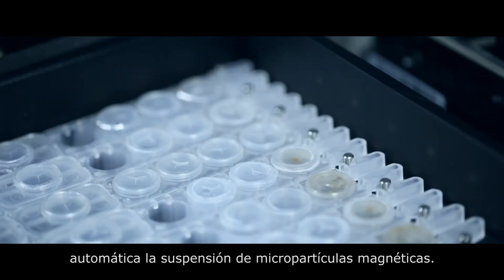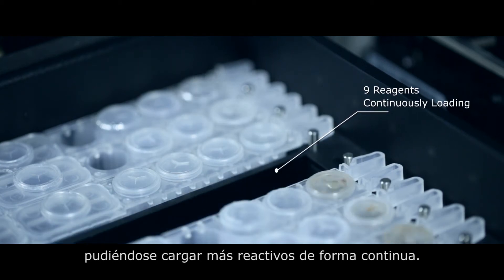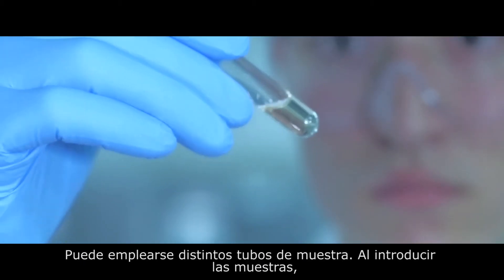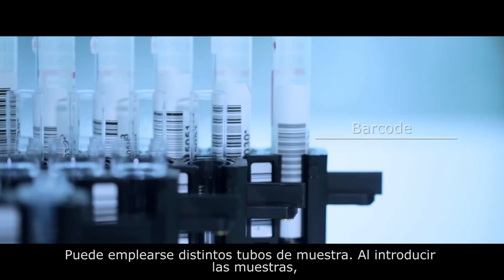Maglumi reagent kits contain a magnetic microbead suspension. These beads are suspended in solution via automatic mixing that occurs after loading. The Maglumi 800 has capacity for nine reagents and can be continuously loaded.